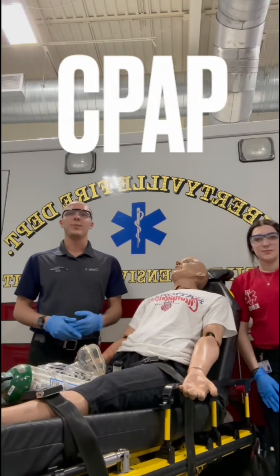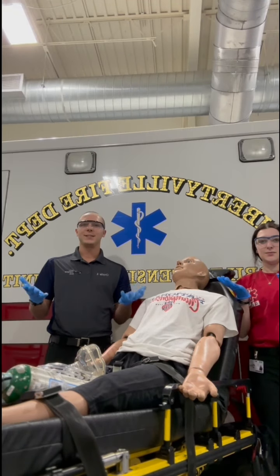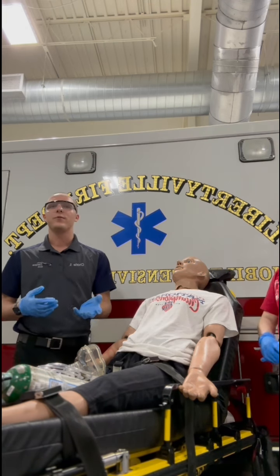Today we are going to be showing you how to place CPAP on a patient. First, we're going to start all of our scenarios with BSI and safety. Some indications when we would use CPAP is going to be anything when there's fluid or secretions in the lungs. So pulmonary edema is a big one, pneumonia as well as asthma.